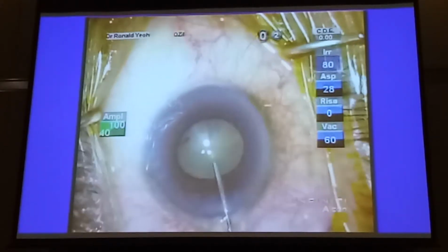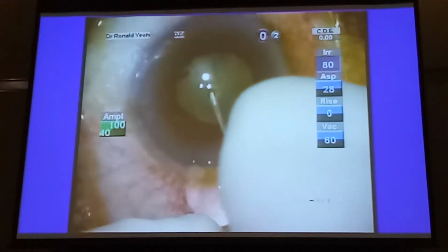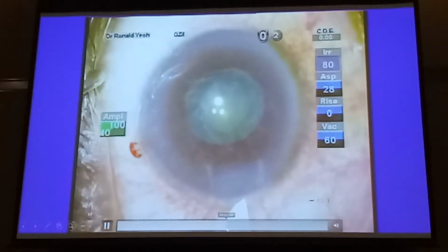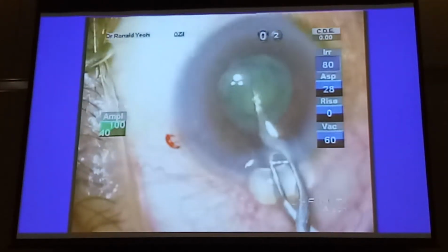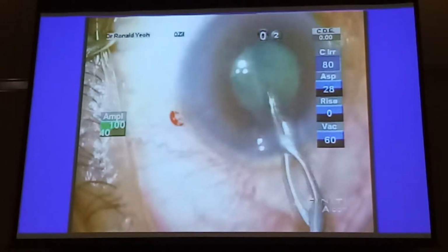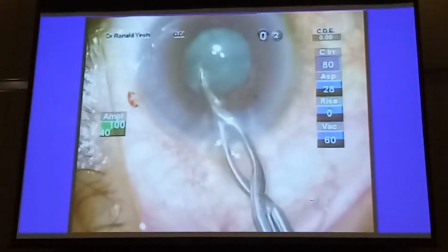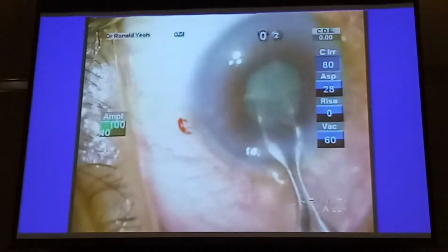That's doable. But again, even with a standard stop and chop and a softish cataract, it's going to be hard to get a nice deep tunnel to get everything done effectively. So here we're just doing a CCC. Let's move that on a little bit more. And here we're going to do the pre-chop. And again, because the pupil is small, it's very nice to be able to pre-chop it like this, because I know that the crack in almost every case extends out to the peripheral nucleus, and I don't have to worry about incomplete nuclear separation. Again, so that was the first crack, and here's the second and third cracks done.